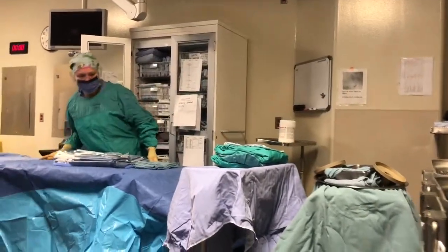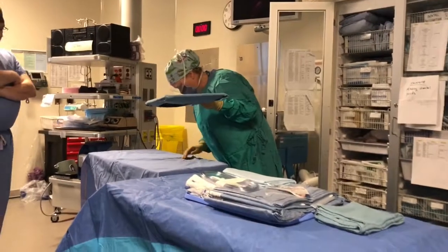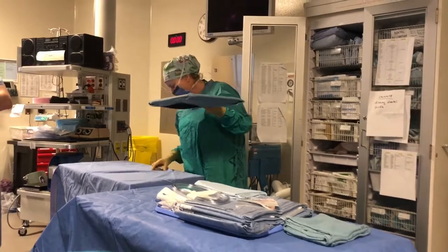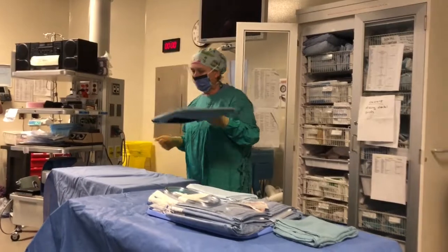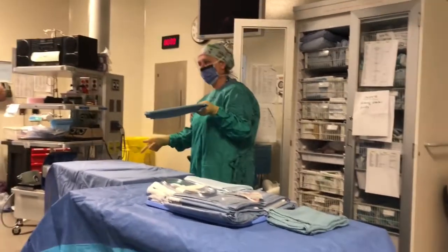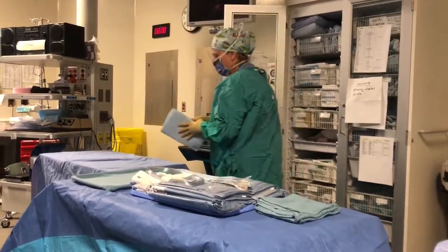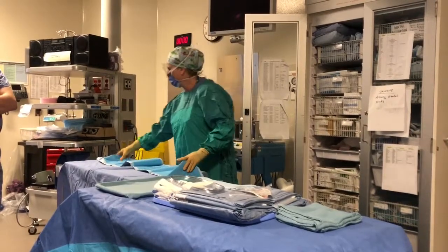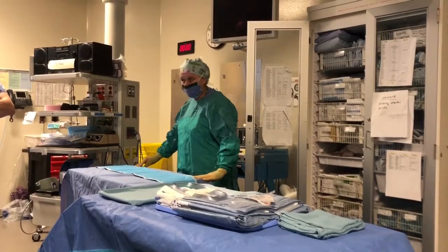All right. So, I'm going to do this. I'm going to make sure there's no holes in my table. I double glove. If I did do this and there was a hole, I can flip off my glove, right? And then hand this off, and then they would just open another one. Okay? So, now I can do this first so that I can move all that stuff off my table, right? You don't want to hit this, right? So you want to make sure that it goes down. This is sterile, so I can step up.